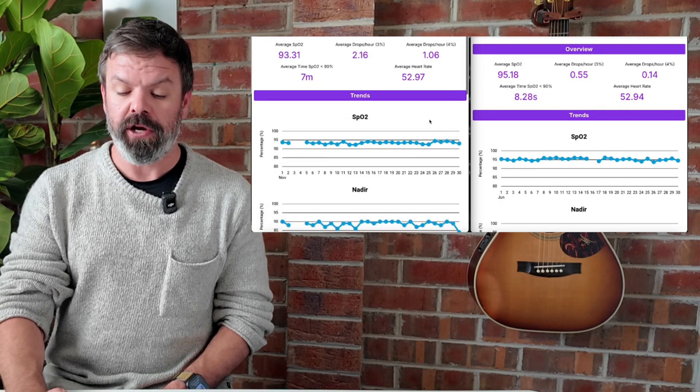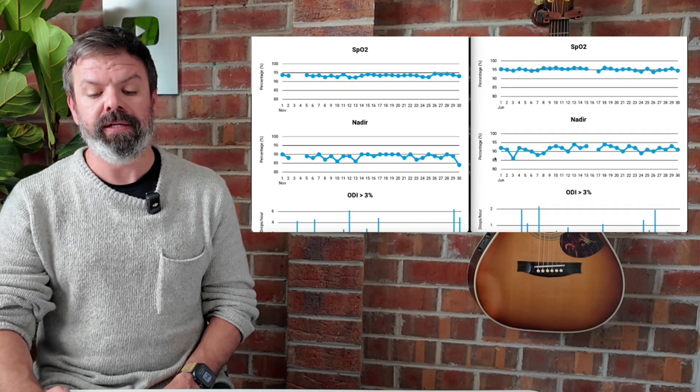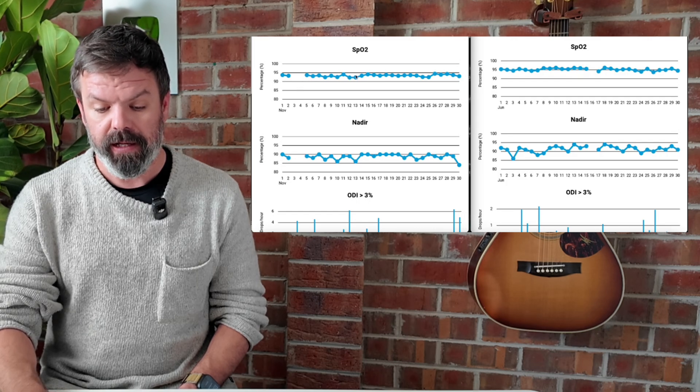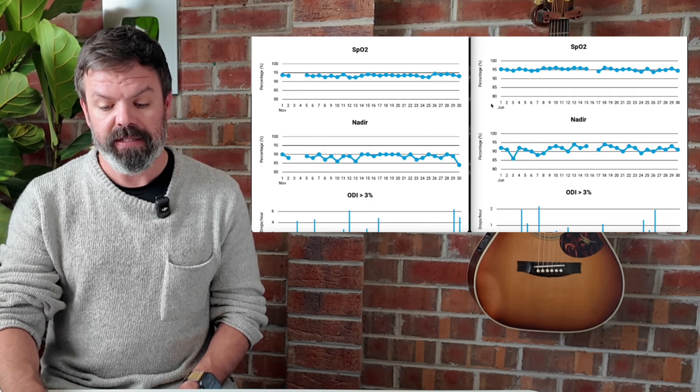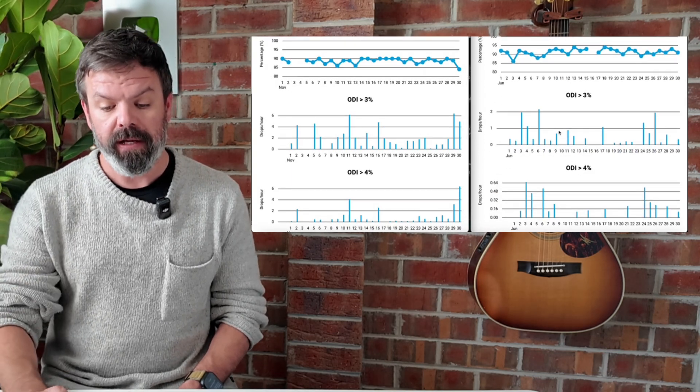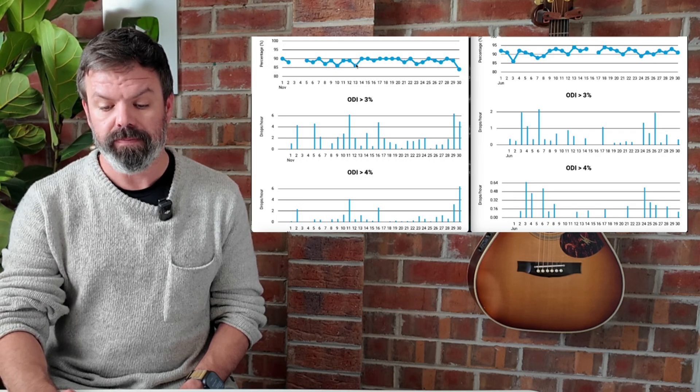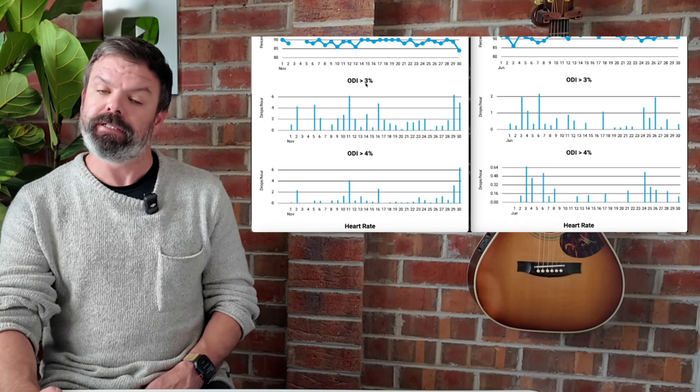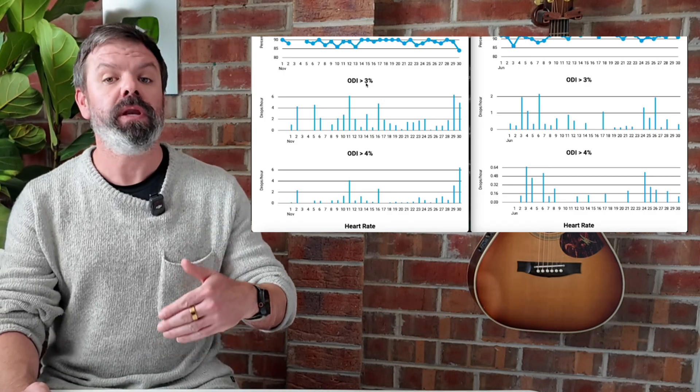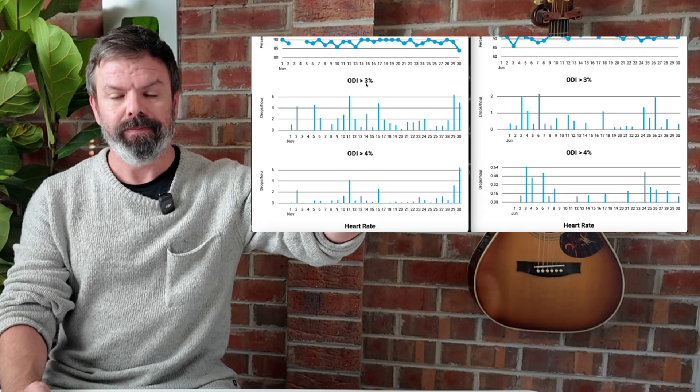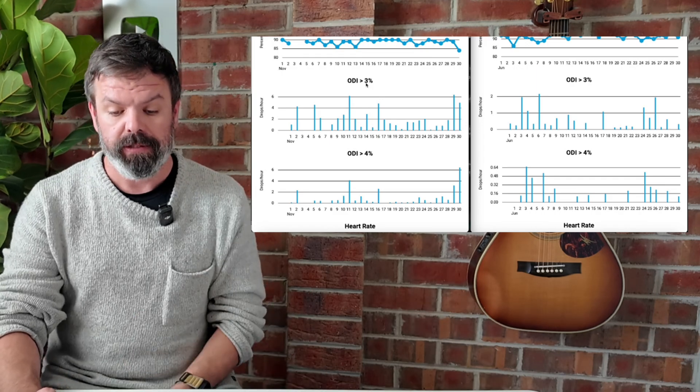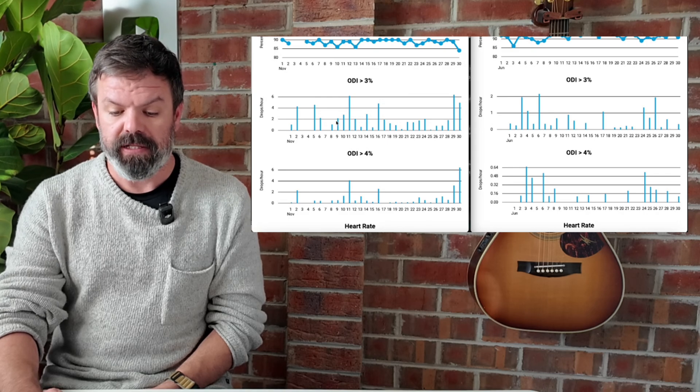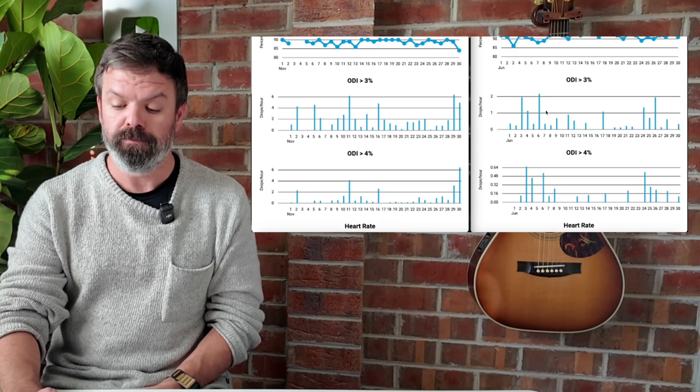And I'll scroll down here and show you the other charts. So this top one is the average blood oxygen levels. And you can see it used to be below 95 a lot. And now it's always pretty much above 95. This next one here, the nadir. So this is the lowest blood oxygen level for the night. And you can see it used to be right down here at 85. And now it's rarely below 90. And you can see ODI more than three percent. So this is the oxygen desaturation index. How many blood oxygen drops you have per hour that are more than three percent from baseline. So if you have a lot of breathing disturbance, your blood oxygen level goes down. This is the count per hour. You can see here up at six, up at six here, five, five, and now pretty much always below two. Really good.